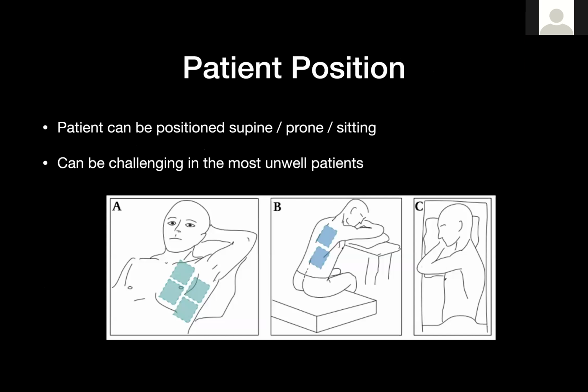Moving on to how we're actually going to do this lung ultrasound, there's a lot of ways you can go about this. The more systematic you are, the more likely you are to catch the changes. And I think that's the headline to take away.